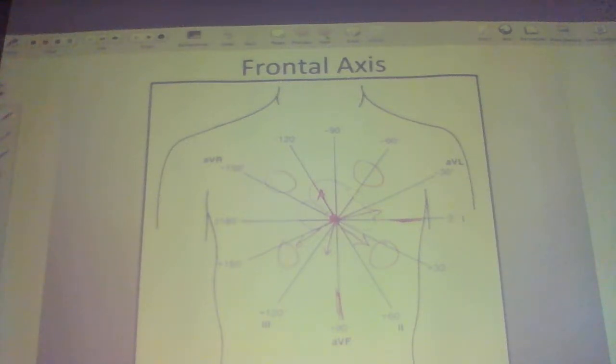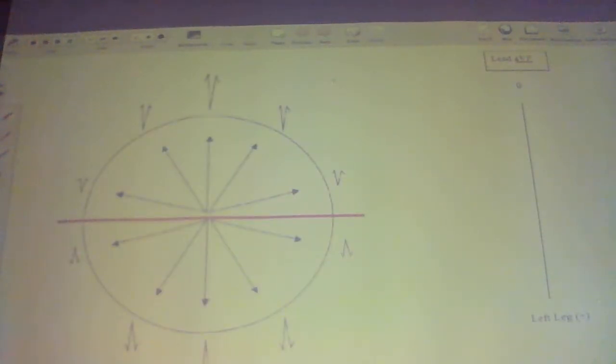So let's take a look at a little bit more. This is just a graphic representation of how the overall QRS complex will appear on the 12 lead EKG, depending on which direction it's traveling in. So if you take this as Wilson Central Terminal, take this as the AV node, the absolute center of the heart, if the ventricles depolarize from the view of lead aVF, so remember lead aVF is our perfectly vertical lead where it's positive down at the left leg. If we have depolarization of ventricular tissue in this direction, like so, you'll see that the QRS is not only upright, but it's going to be the tallest of all of the other QRSs.